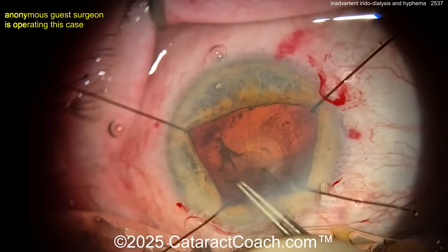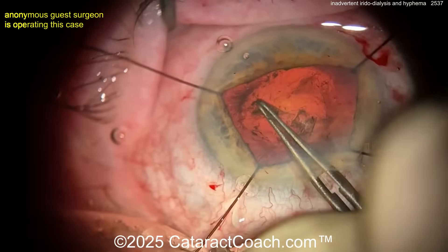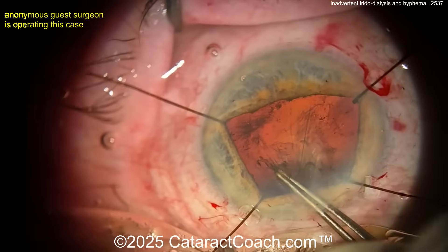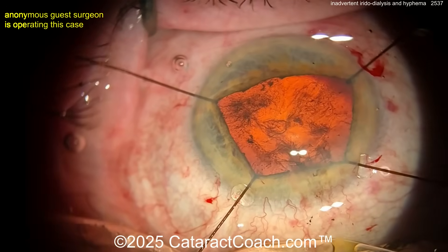But it's up to you — do what makes you happy. Now getting that rhexis completed. Look at all the synechiae that were stuck on that anterior lens capsule — those are coming off too, along with that iris pigment. Now the rhexis is completed and that looks pretty darn good.